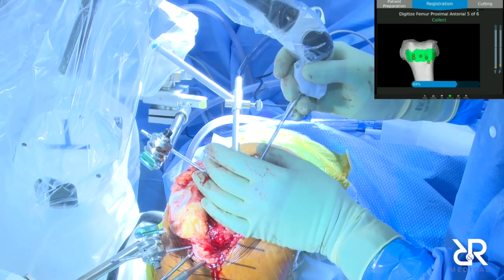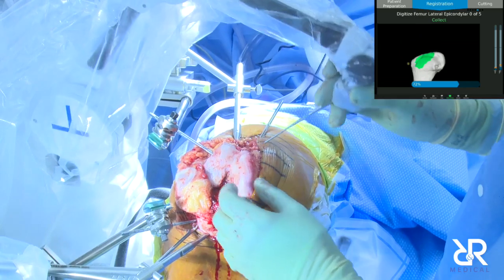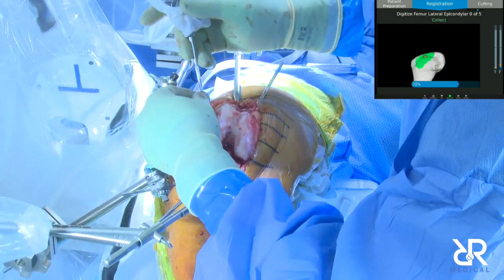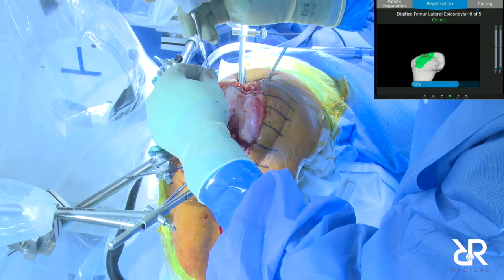You know what your varus cut is. You kind of anticipate any kind of issues. So I like that aspect of it, from a planning standpoint.